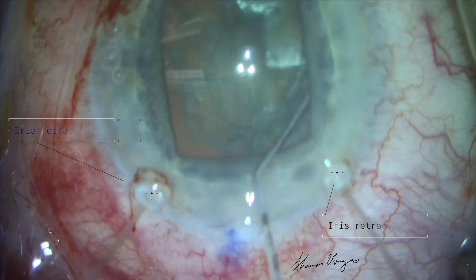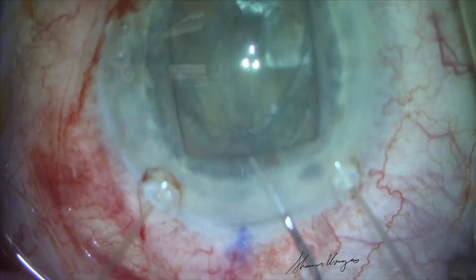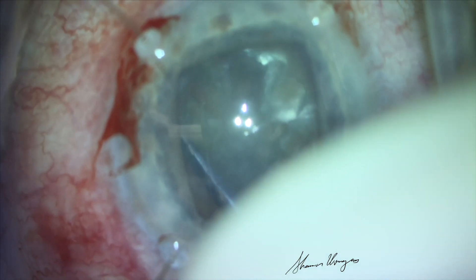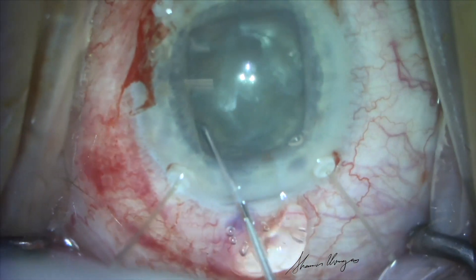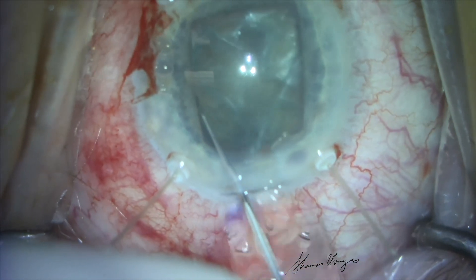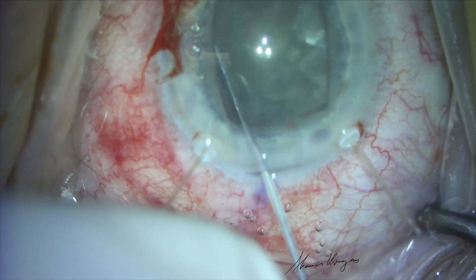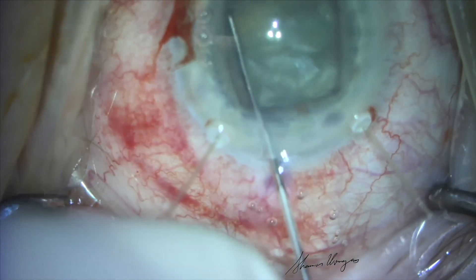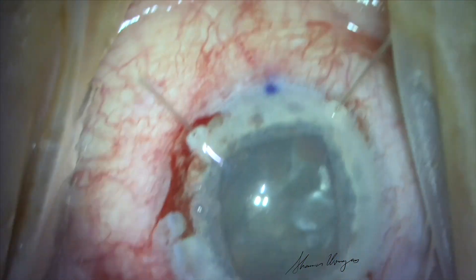We place iris retractors to improve our view of the lens and anterior capsule. We repeat our hydrodissection so we can rotate the nucleus more easily without stressing the zonules. After more viscoelastic is placed into the anterior chamber, we try to rotate the nucleus clockwise toward the area of zonular weakness at 2 o'clock. Ultimately, using a Chang hydrodissection cannula, we are able to rotate the nucleus.